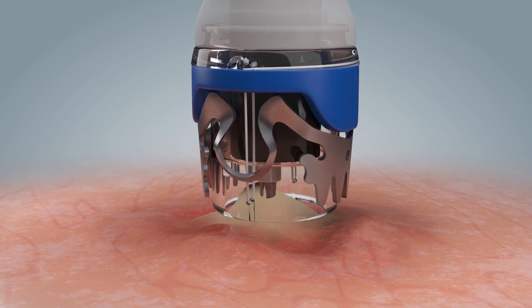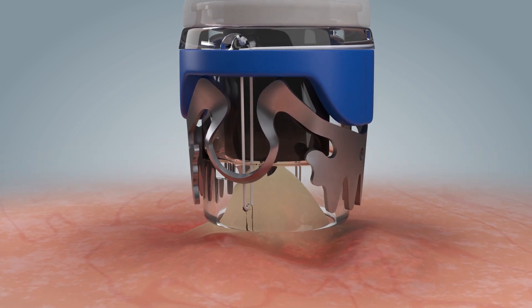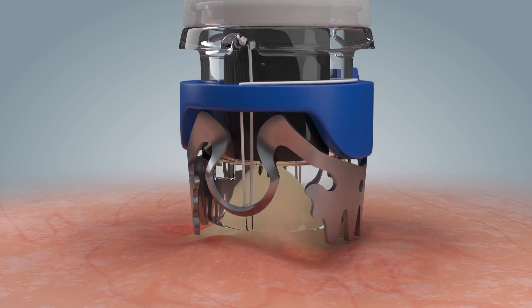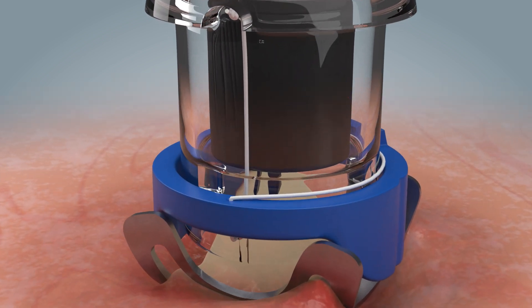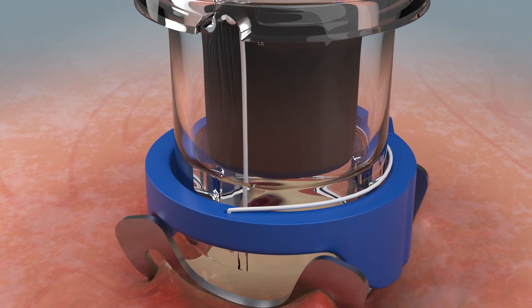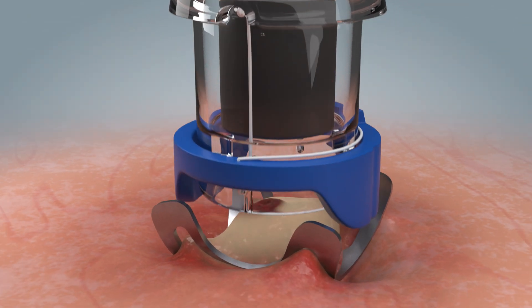After mobilization of the tissue in the cap, the clip can be applied. It is important to ensure that the tissue is retracted far enough into the application cap. Once the clip has been successfully placed, the anchor is retracted and released from the tissue. It can then be removed from the working channel and the application site can be inspected.